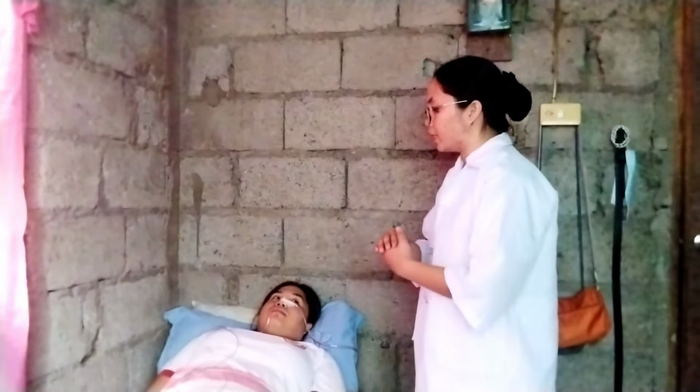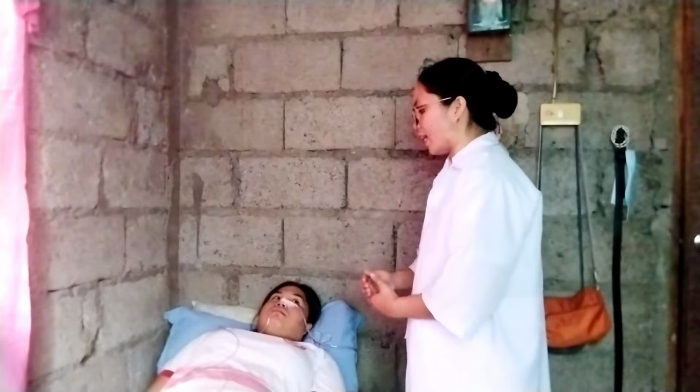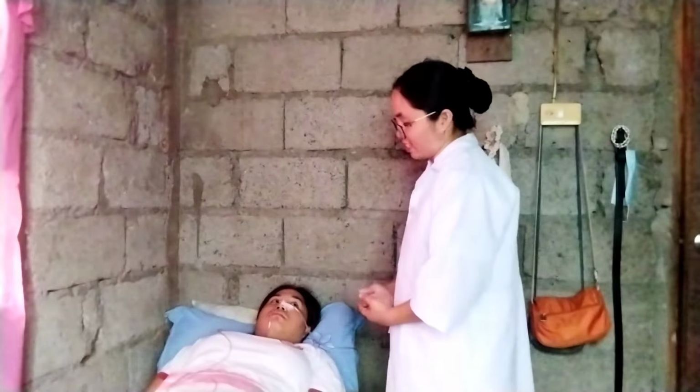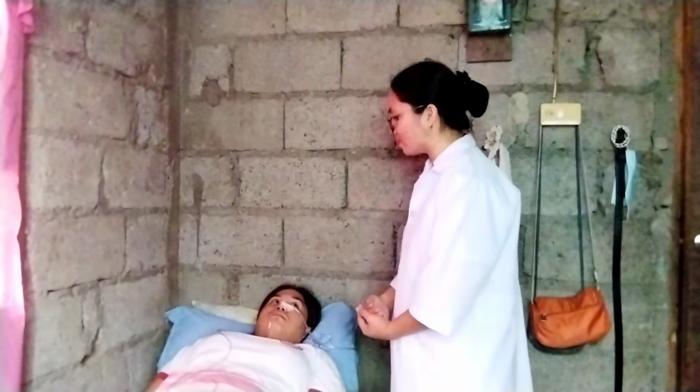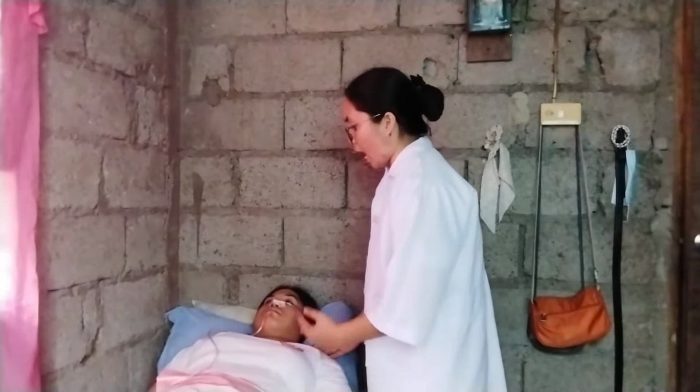Ma'am, the procedure we will be doing is nasogastric tube feeding. Ma'am, you need to cooperate with this kind of procedure so that it will maintain your nutrition while you have an underlying condition. Is that okay, ma'am? Ma'am, before we start the procedure, I would like to inform you that you will feel fullness rather than discomfort. Okay, are you ready? Okay. Let's start. Ma'am, I will just position you in a high Fowler's position or upright sitting position.